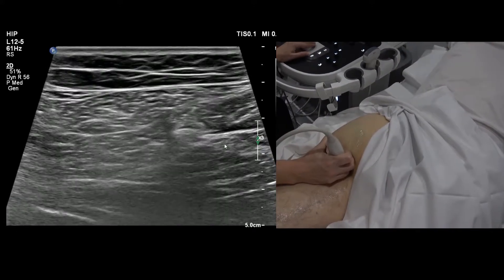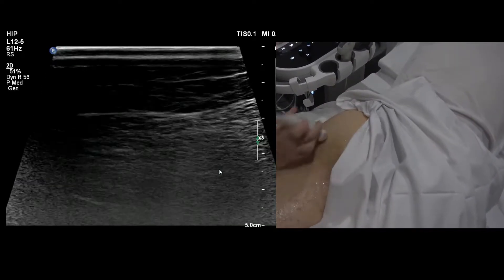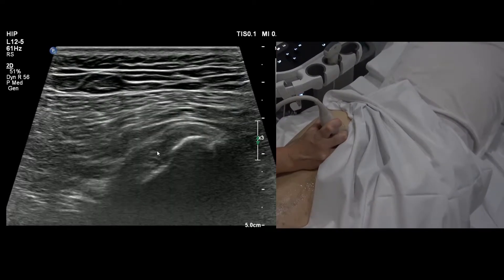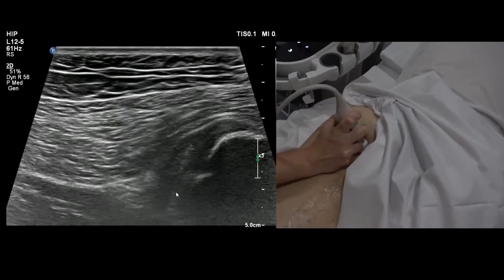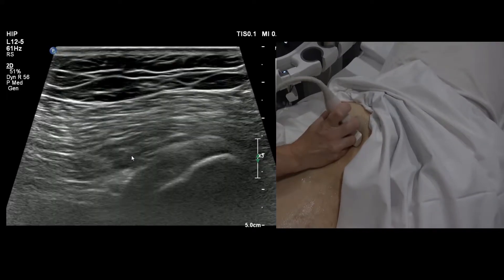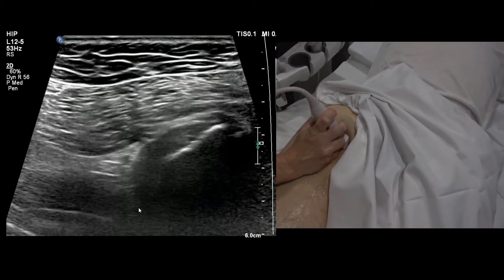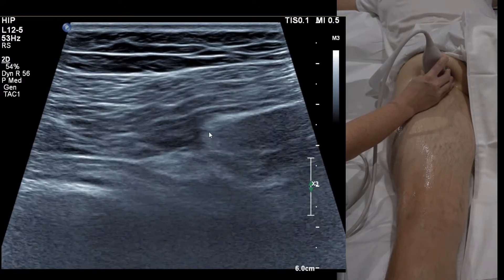Sciatic nerve here, semimem there. Semimem ends up being the deepest, most lateral tendon of the hamstring origin. Up at the ischium, this is all conjoint tendon — hamstring origin. The deepest, most anterior and most lateral part is semimem. Remember: semimem is medial at the bottom but lateral at the top. You can use a curvilinear probe here, and as you go up, this conjoint tendon becomes the main hamstring origin.